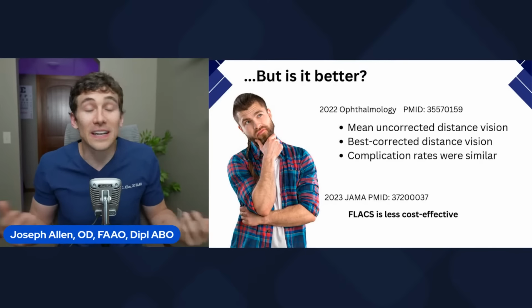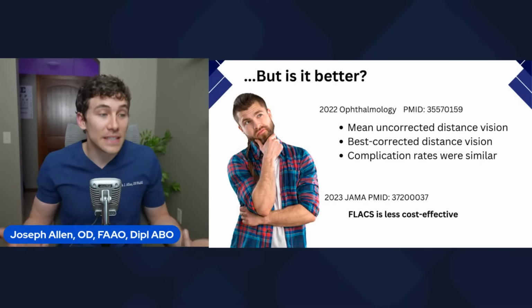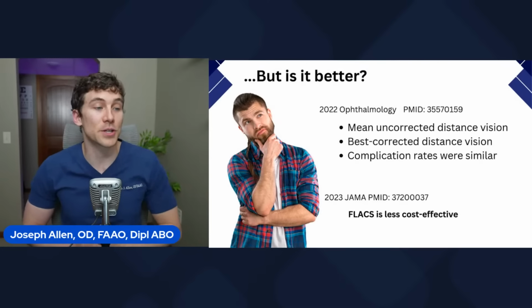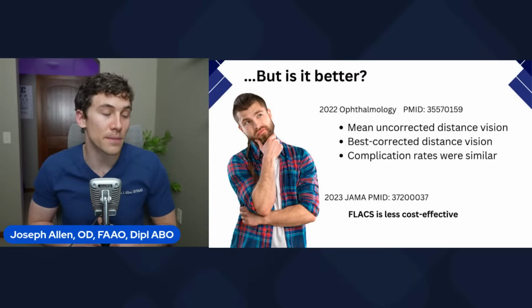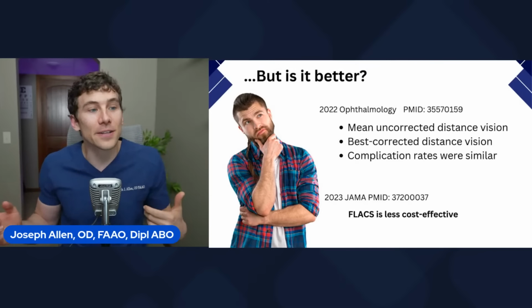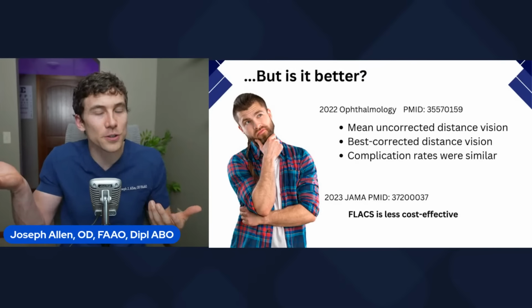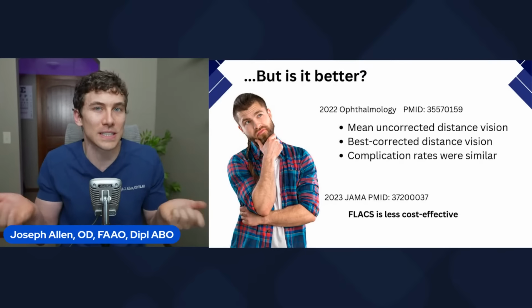And they also found that complication rates were the same. Furthermore, even in 2023, a recent publication from the Journal of the American Medical Association found that this laser cataract surgery is just less cost effective, because the outcomes of traditional surgery versus the laser are almost the same.